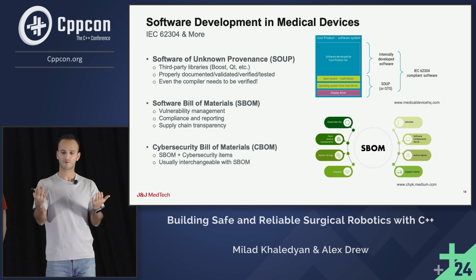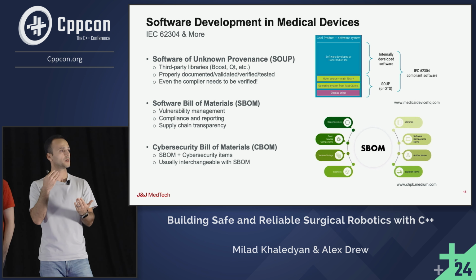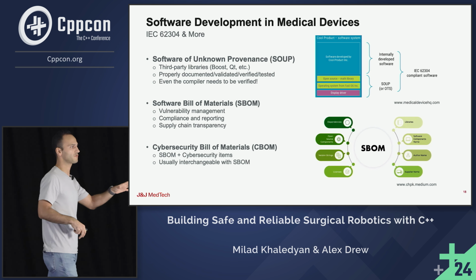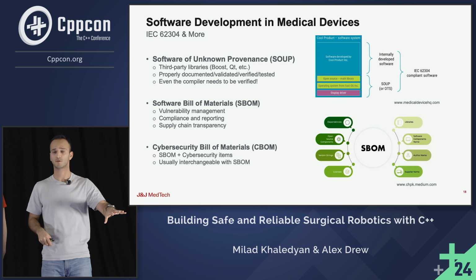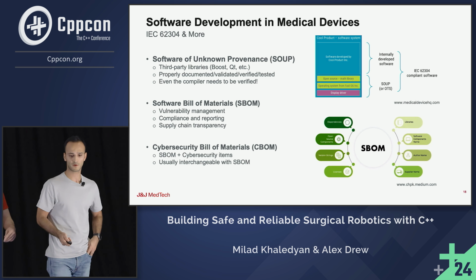Maybe the government has their own version of the SBOM and can match these two to find out if you have essentially ignored any sort of vulnerability within a software. I believe even right now, at least from two years ago, if your company doesn't do safety critical work but you contract with the government, most likely they'll require you to submit an SBOM for the third-party libraries used, due to cybersecurity vulnerabilities.